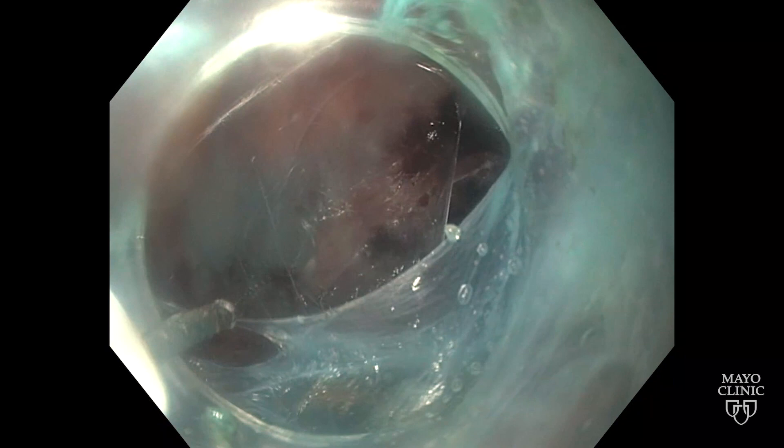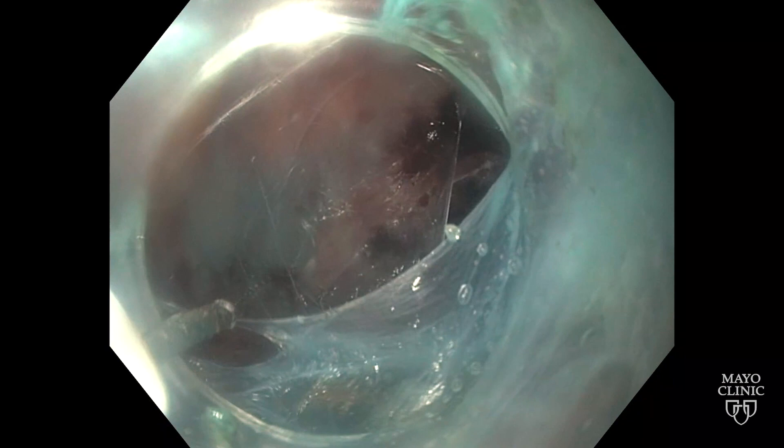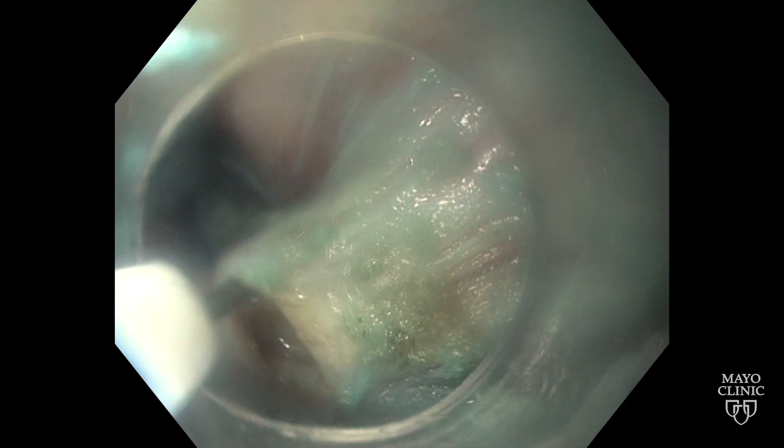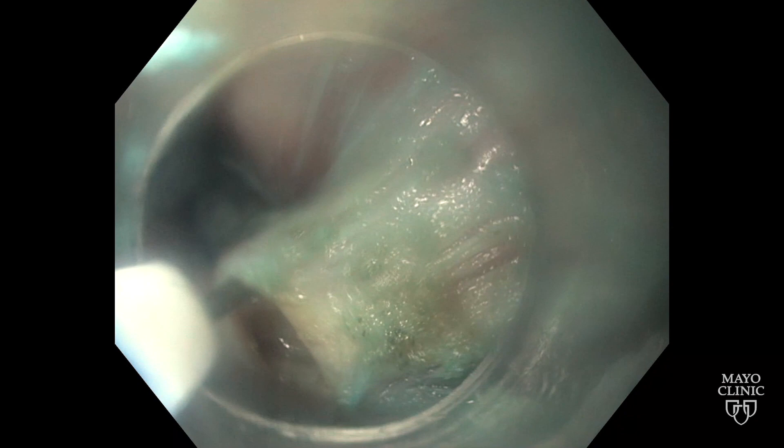The scope is then passed underneath the lining of the proximal GI tract into the submucosal space, and a tunnel is created on both sides of this hypertrophic muscle. The muscle is then subsequently divided using an electric knife.